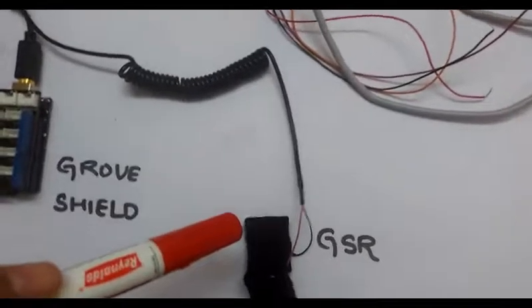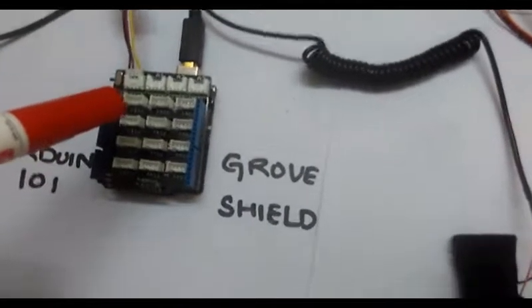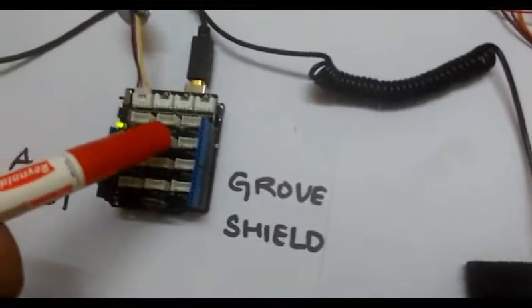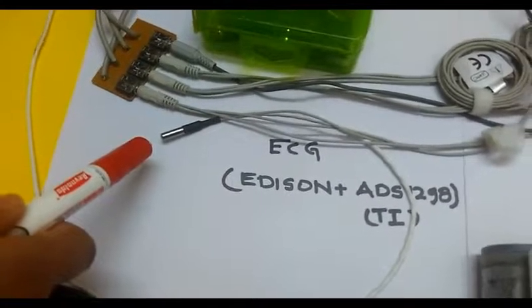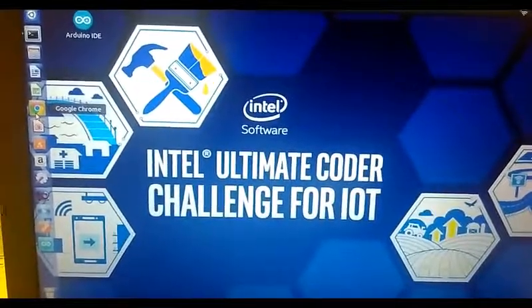The galvanic skin response will be sensed by this GSR sensor, and this is a Grove Shield plus Arduino 101 board, and this is the digital temperature sensor DS18B20. After going through the sensors, let me take you to the doctor's web page.